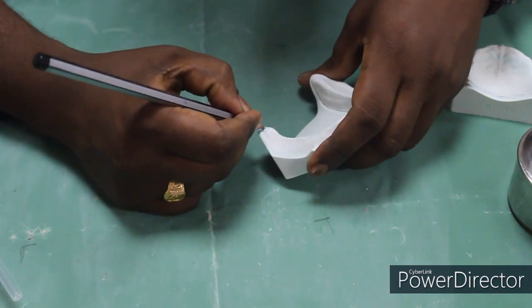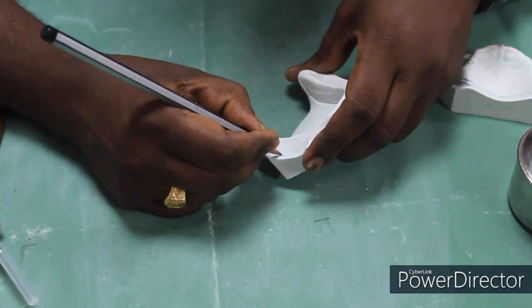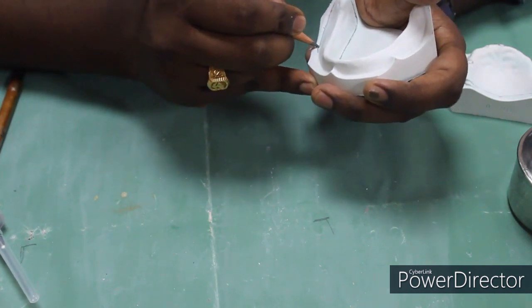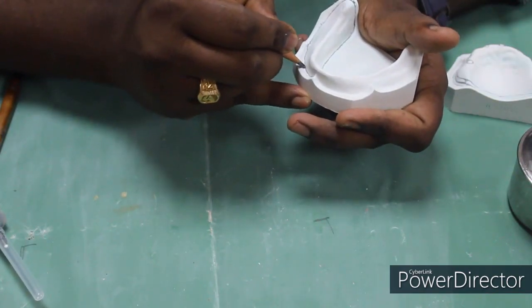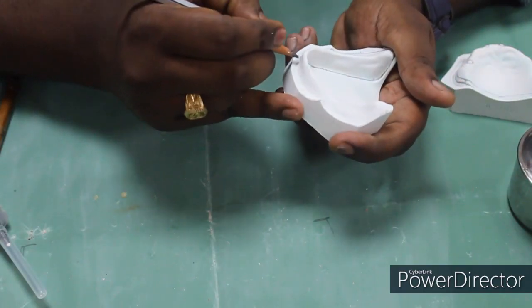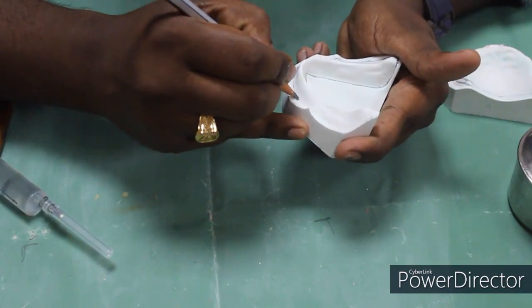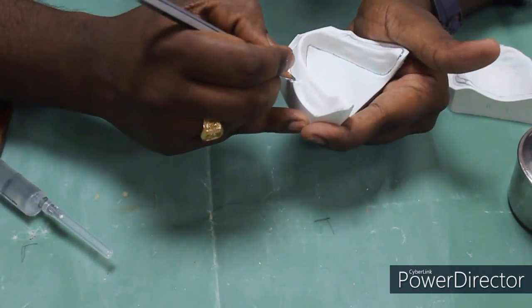We are covering the retromolar pad area and extending onto the buccal sulcus, buccal frenum, labial sulcus, and labial frenum. As I mentioned, you have to follow the anatomical ups and downs. There is a frenum relief, all those things you have to follow in this depth of sulcus outline.